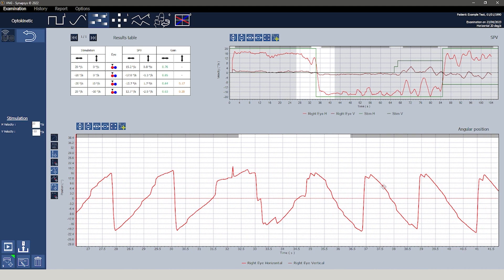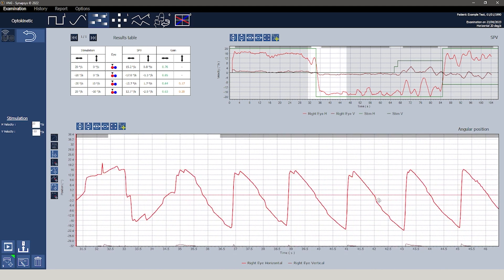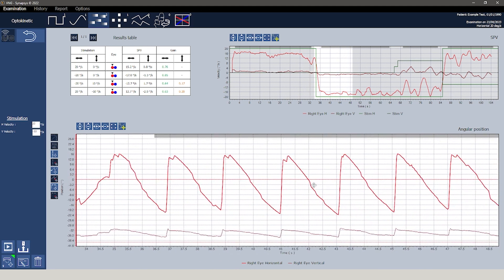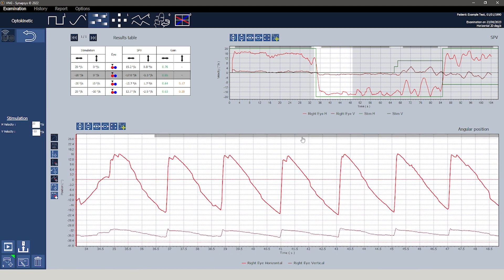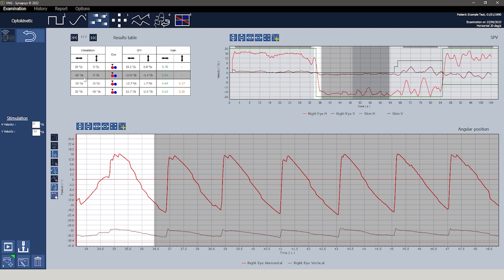In the upper left segment is a results table which presents data on slow phase velocity and gain according to the type of movement and gaze analyzed.